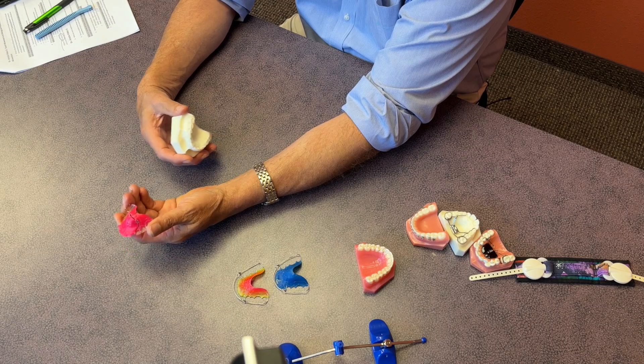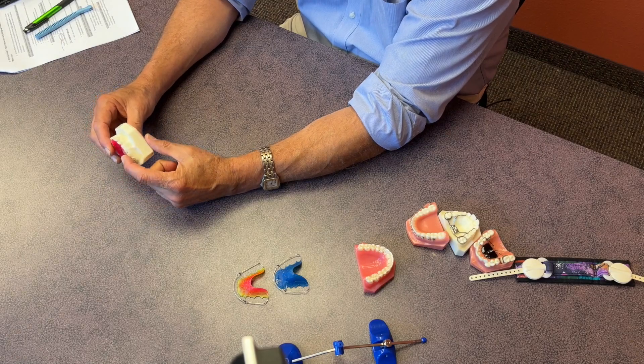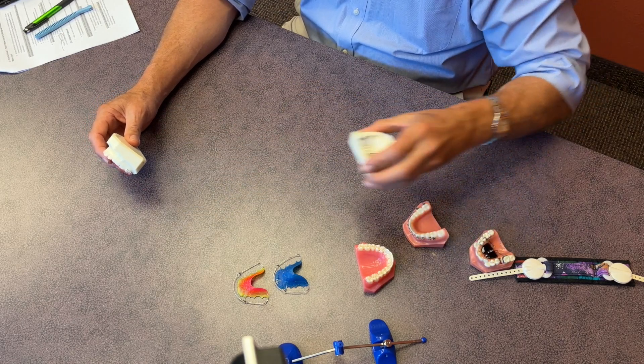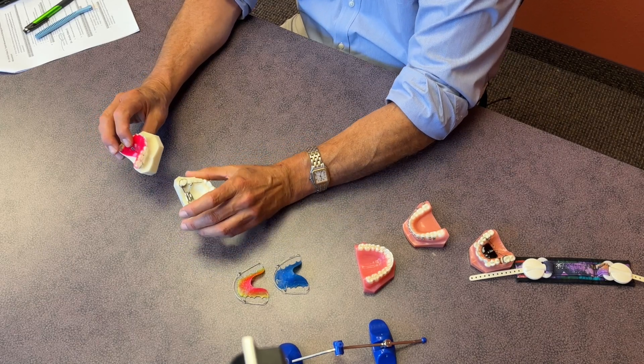Removable appliances might also accomplish expansion — they're worn all the time except when eating or brushing. An appliance like this pushes and moves the teeth at a slower rate. The kind of control we have with a removable appliance versus a fixed one is different, and there are different reasons and different protocols or indications for each.